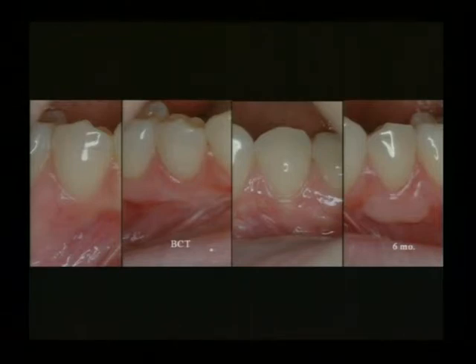First, look at the pre-op. You can appreciate with the vascularity here that this is pure mucosa. Look at this. If you were to look at this, could you tell anything had ever been done there? I don't think so. And I think that's where we're moving in the next generation of grafts.